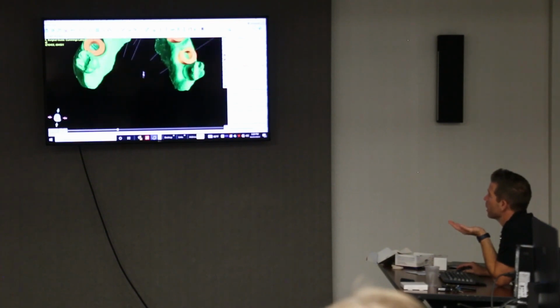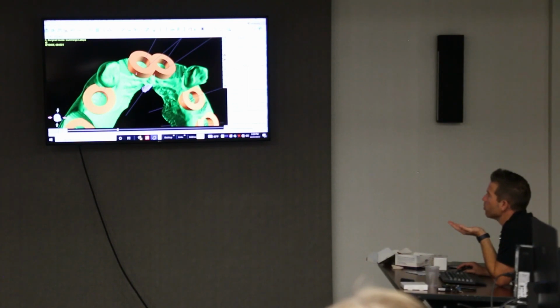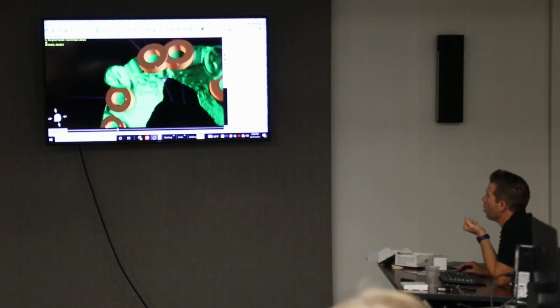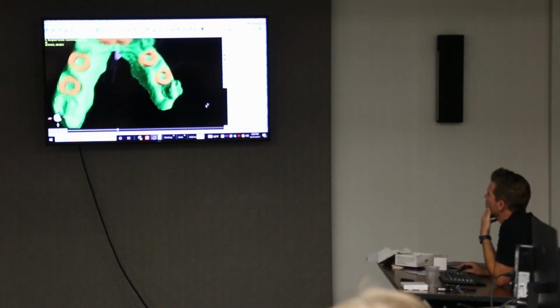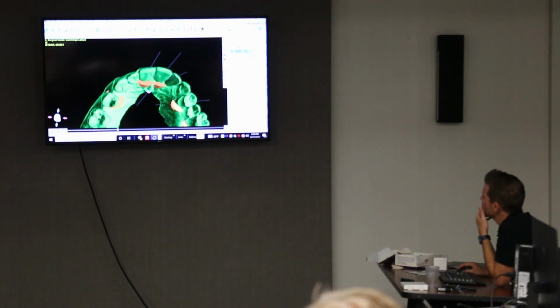You can see we left her canines and second molars. And remember, it's the inner portion of the guide tube that is critical. So don't get hung up that the outer portion of the guide tube is running into the model. Look in your inner portion of the guide tube, and it's all there. So I want everybody to watch me here. If you want to do it, you can. So you can see this is where she started, right?